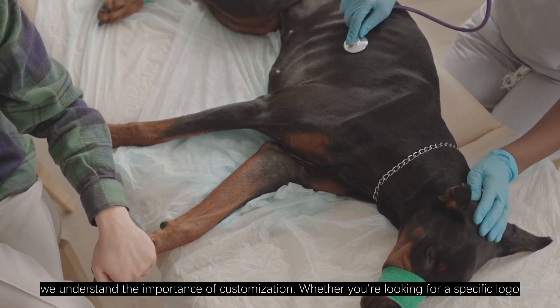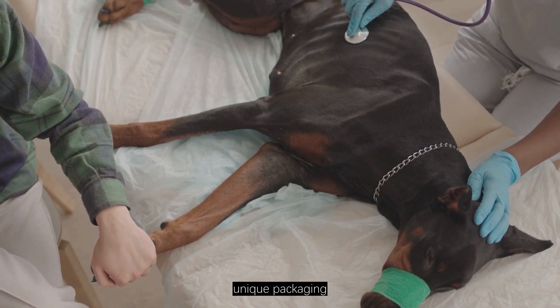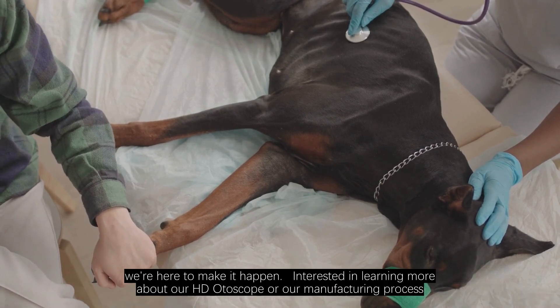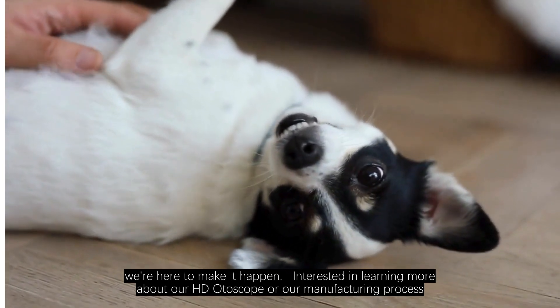At Rescope, we understand the importance of customization. Whether you are looking for a specific logo, unique packaging, or a particular style, we're here to make it happen. Interested in learning more about our HD otoscope or our manufacturing process?